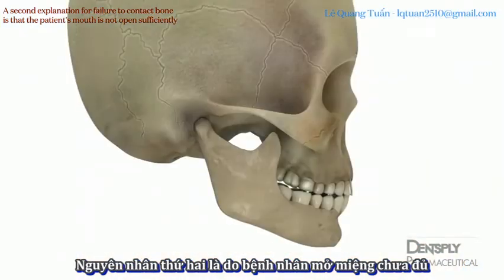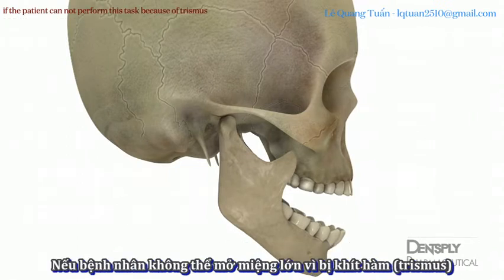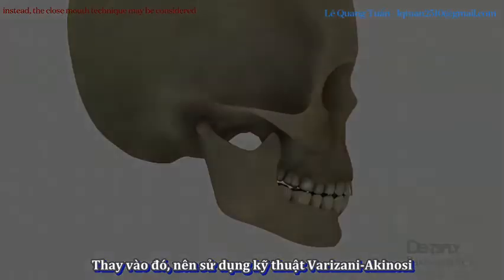and the barrel of the syringe moved mesially along the contralateral quadrant before reinserting the needle to the final depth. A second explanation for failure to contact bone is that the patient's mouth is not open sufficiently for the neck of the condyle to rotate downward and translate forward into the plane of insertion. If the patient cannot perform this task because of trismus, then the Gow-Gates block should not be attempted.